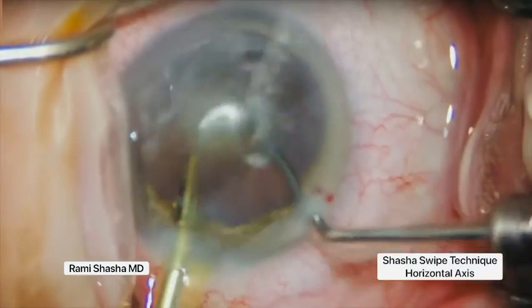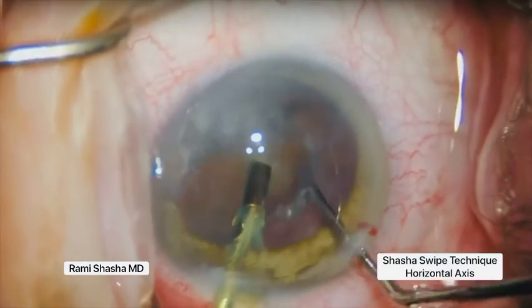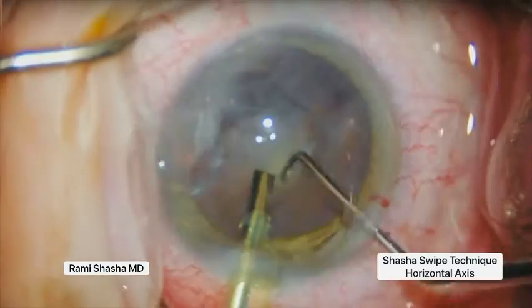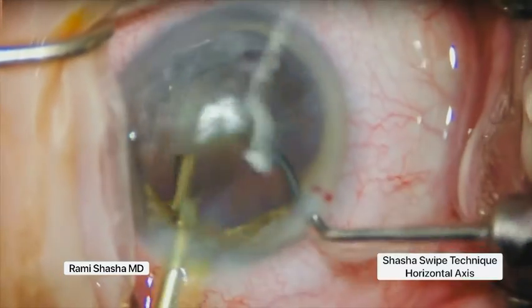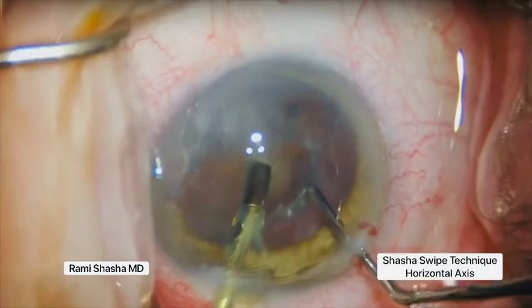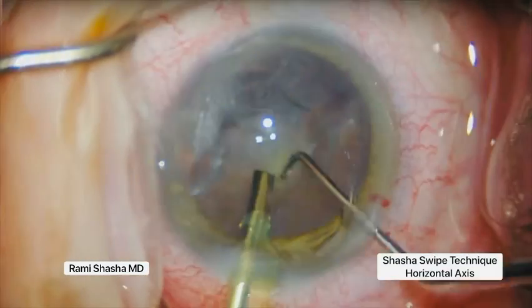In this technique, the chopper will dive down under the hemi nucleus and will elevate it up into the central safe zone. The phaco tip and chopper are then directed towards each other on position one along the same horizontal axis, with the fragment sandwiched in between. This will bisect the hemi nucleus into two pieces and is carried out entirely on irrigation alone.